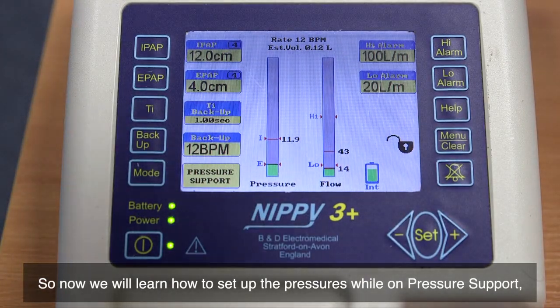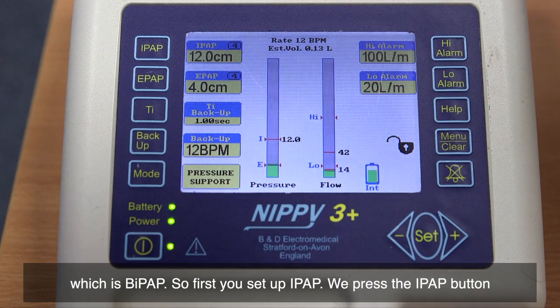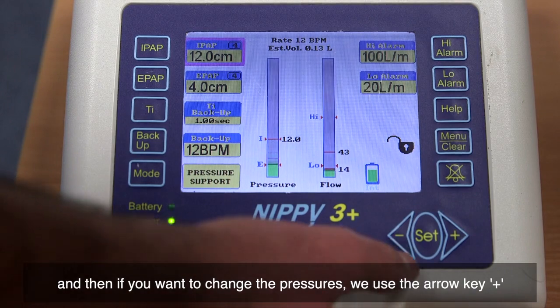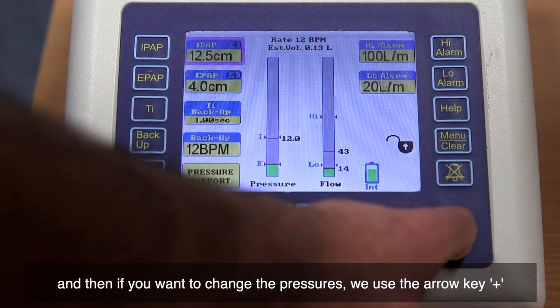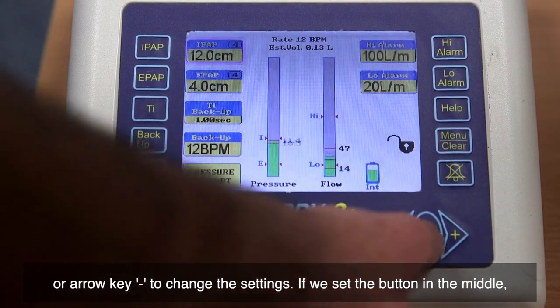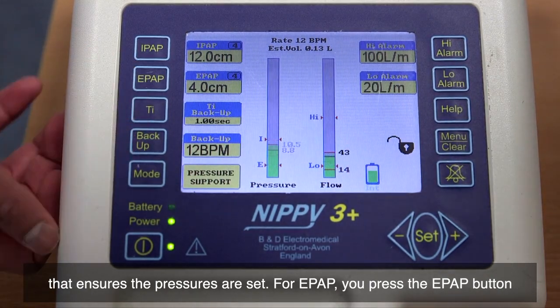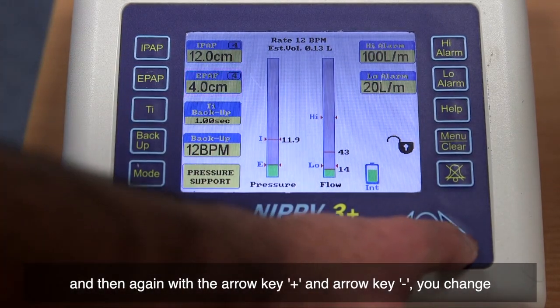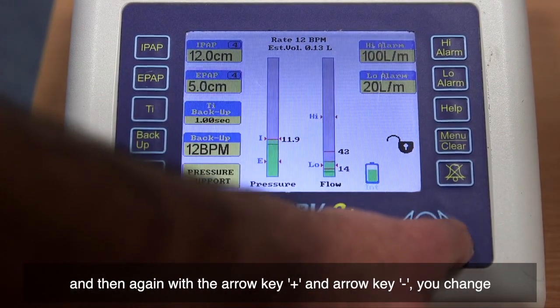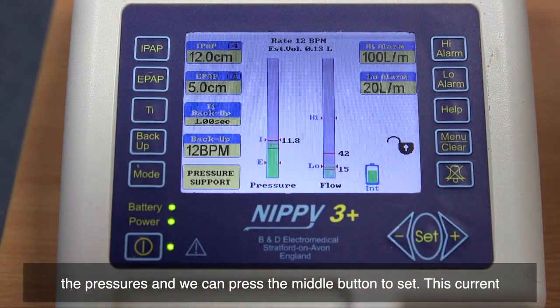Now we will learn how to set up the pressures while on pressure support, which is BiPAP. First, to set up IPAP, press the IPAP button and then use the arrow key plus or arrow key minus to change the pressures. Press the button in the middle to confirm the setting. For EPAP, press the EPAP button and again use the arrow keys plus and minus to change the pressures, then press the middle button to set.